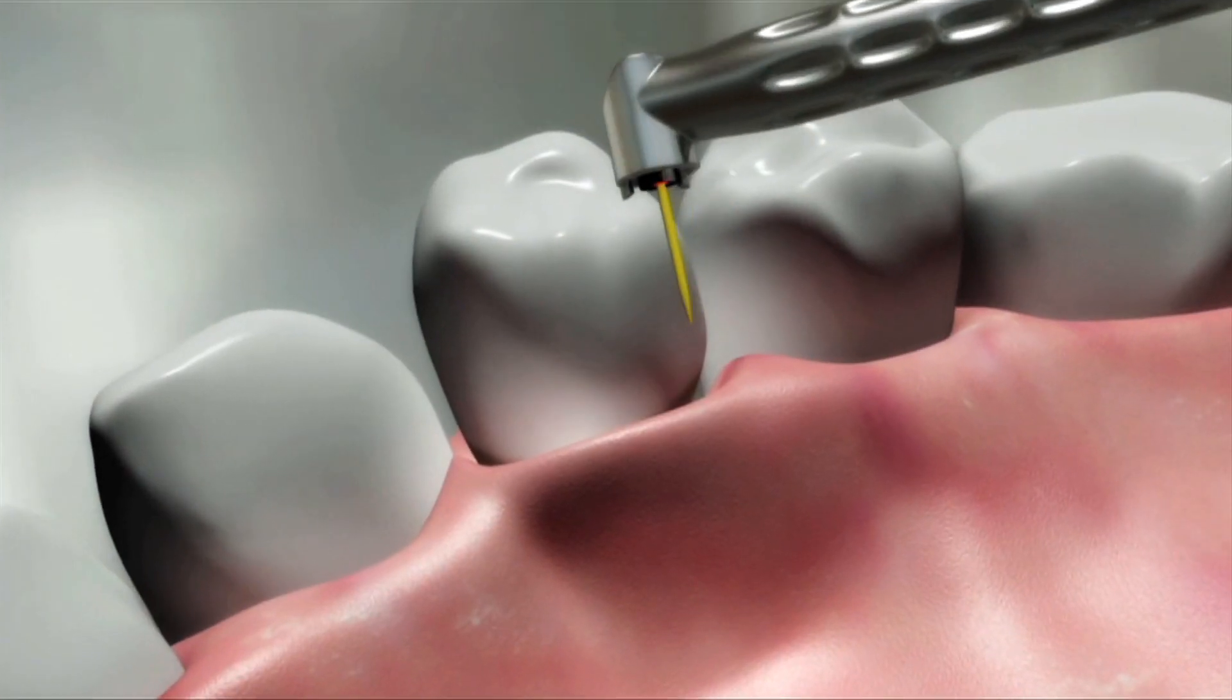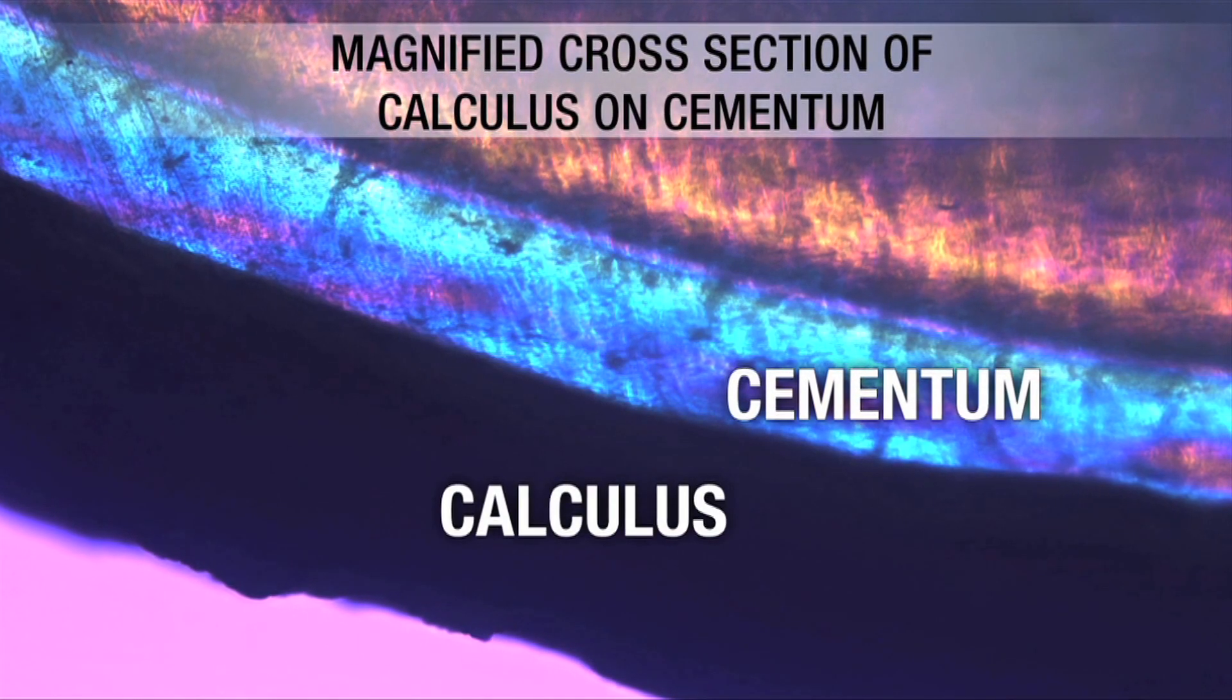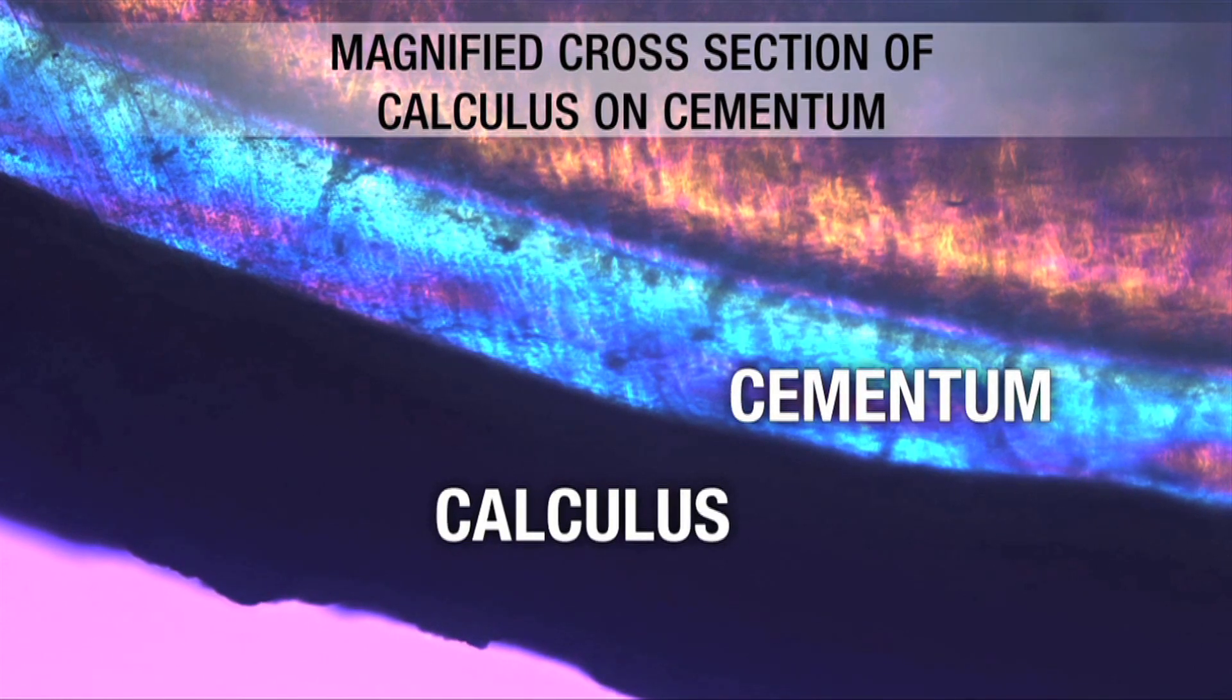Next, we insert a specialized Erbium YAG handpiece tip with water spray into the pocket to remove calculus at sub-ablative laser energy. The special tip utilizes photon-induced photoacoustic streaming, or PIPs, to remove the calculus and disrupt the destructive biofilm on the root surface.